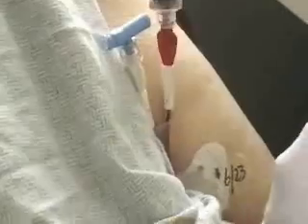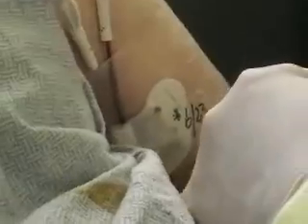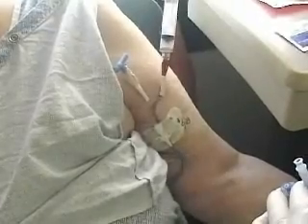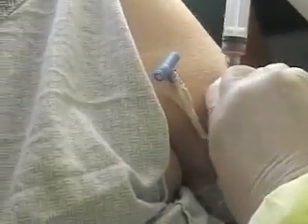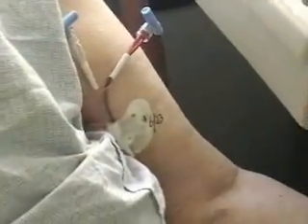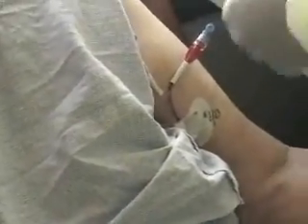Can you put your hand a little straight here? There's a new PICC line — it was placed yesterday. I don't know if it doesn't want to give me blood. It doesn't really give me blood. I'm just going to flush it so I don't waste anything here.